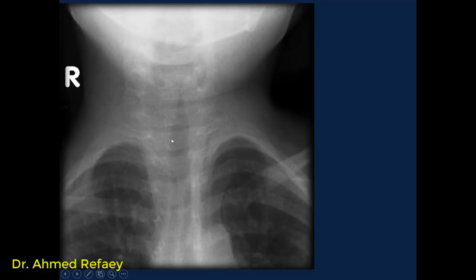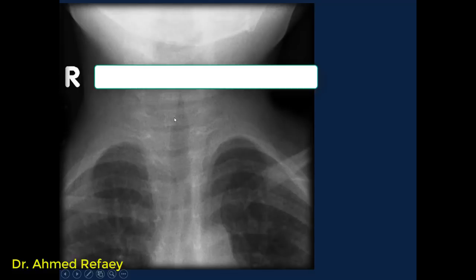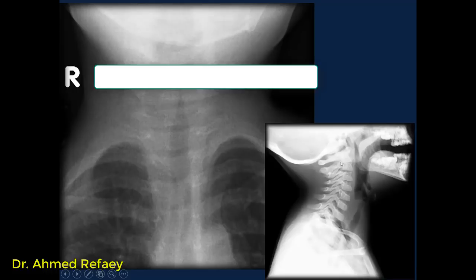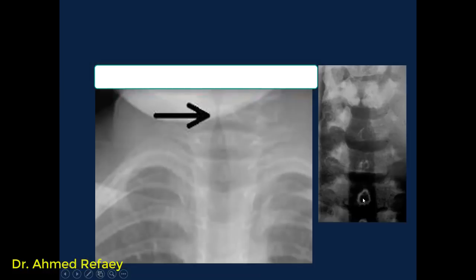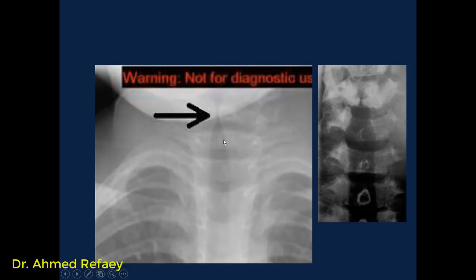This is a case of croup. We have complete loss of the subglottic shoulder, giving the appearance of an inverted V shape or steeple sign. On the lateral neck X-ray of the same patient, we can appreciate normal epiglottis and normal aryepiglottic fold. Another example of croup showing loss of subglottic shouldering giving the inverted V or steeple sign, compared with the normal subglottic shouldering appearance.